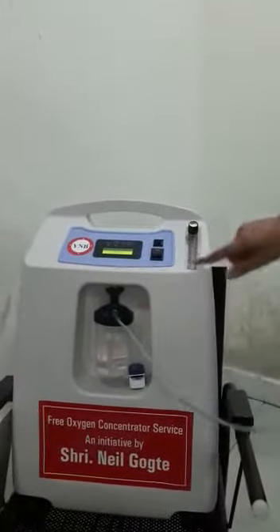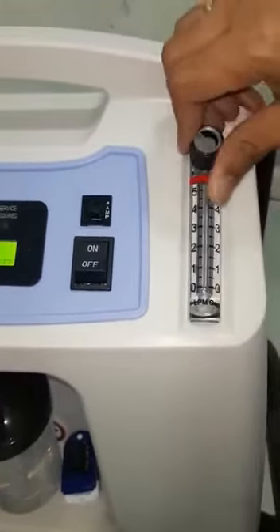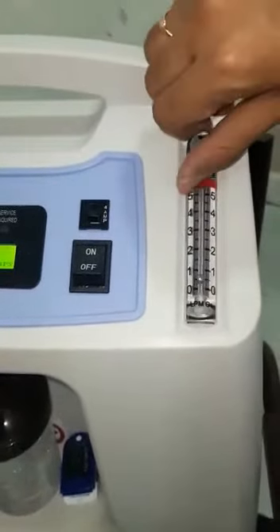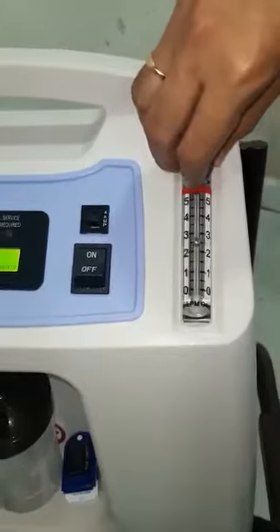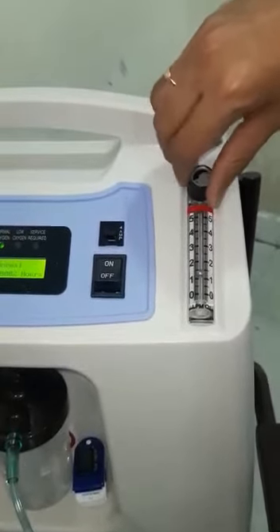Once you switch it on, there is a meter which shows 0, 1, 2, 3, 4, 5 — that means how many liters you are giving per minute. 1 liter per minute, 2 liters, 3 liters. Ideally for all patients, put it between 1 to 2 liters and wait and watch.